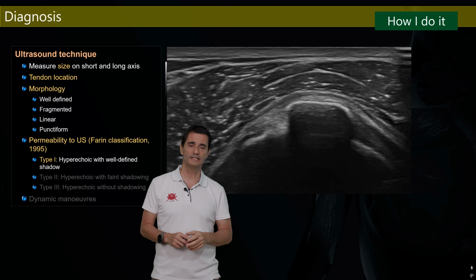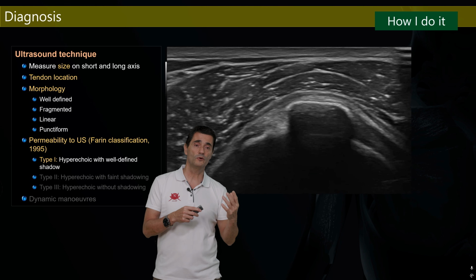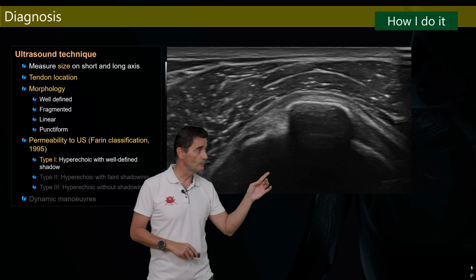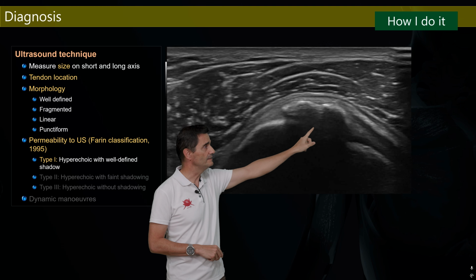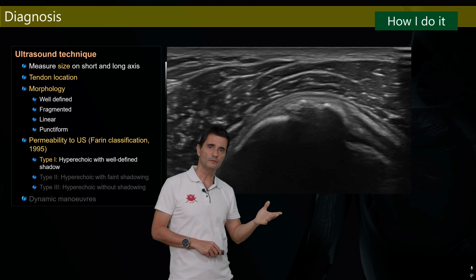It's very important, the fine classification for me, because it correlates with what I am going to find with the ultrasound and the puncture and the needle inside the calcification. So in this type 1, I'm sure the hardness of the calcification will be terrible, and it will be difficult to get inside the calcification and to evacuate. Not impossible, but difficult.